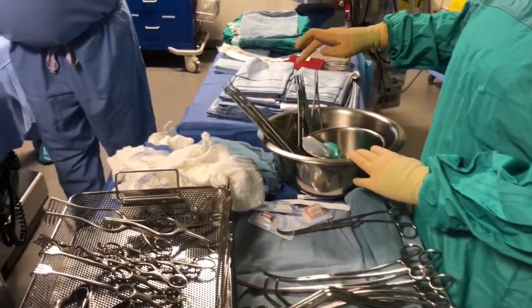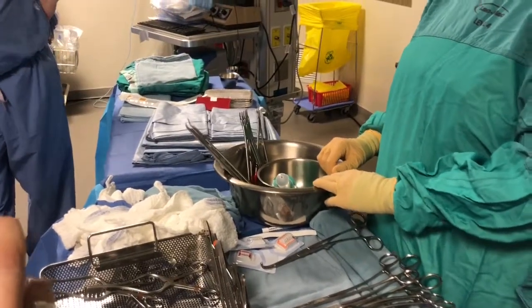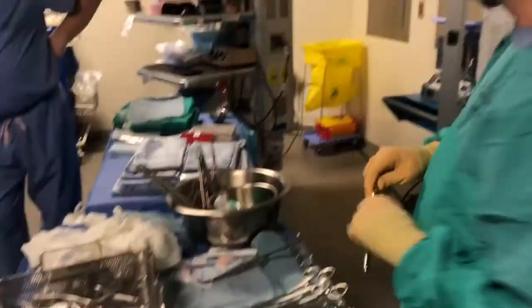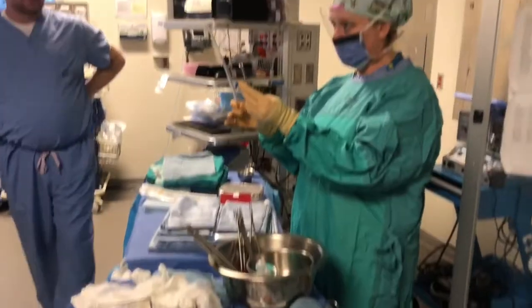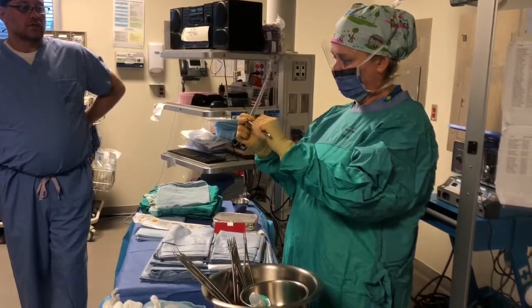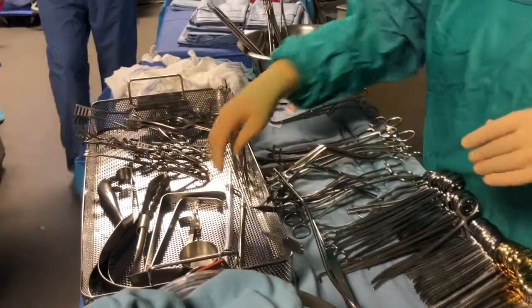Yep, so there's 1, 2, 3, 4, 5, 6, 7. Okay, and then we would do suction, so there'd be 1, 2, and there's a third one. Yeah, the anchor is under the... Right here. Three pieces, because this comes apart. Okay, so that'd be 3. And then tissues would be next.